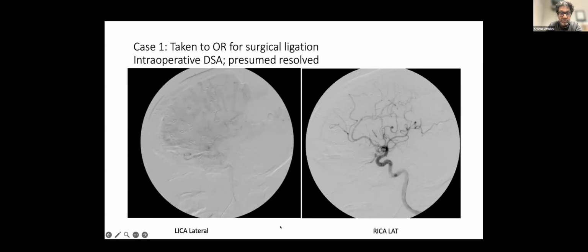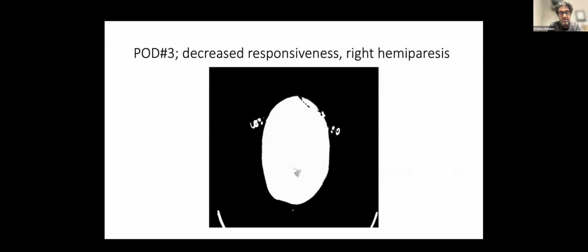We did both internal carotid runs, and presumptively, we all came to the conclusion that the variceal portion certainly was occluded. But that, along with the fact that he microdopplered the dura, and microdopplered where the clips were, and there was no pulsatility. So again, we presumed we were in an okay position.